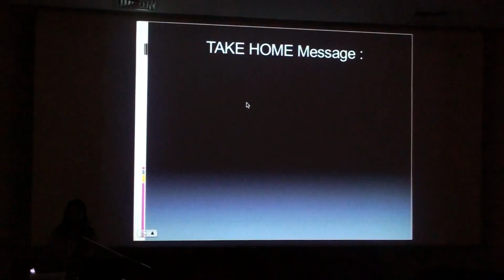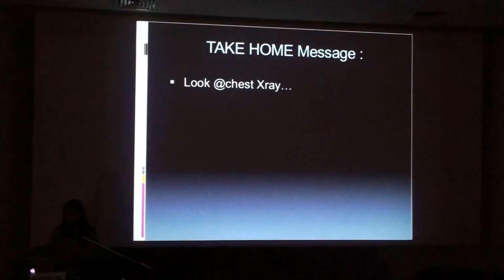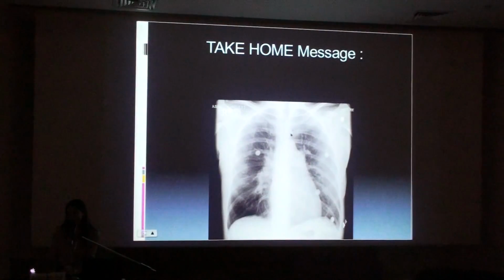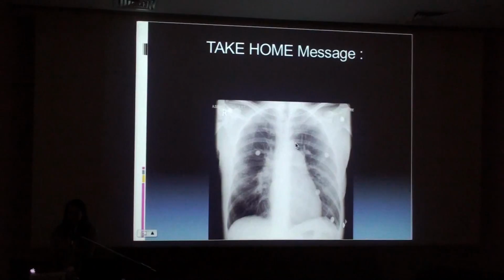So what is the take-home message? Look at the chest X-ray, because you already had the sign of PH with enlargement of the main pulmonary artery.